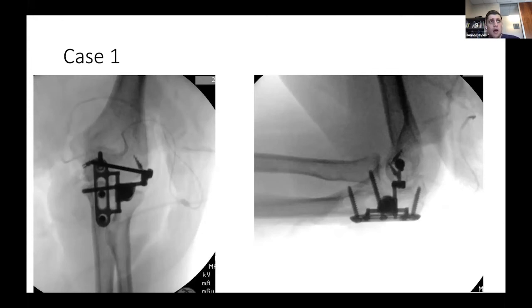And what I look for on the lateral is any lengthening or widening of the ulnohumeral joint, so a sag sign or a drop sign. And I look for radiocapitellar sort of sagging. And then on the AP, I look for an ulnohumeral joint incongruity. So is there widening on the medial side? Is there widening on the lateral side? And if I have none of those things, then I'm stable, and then I'm happy, and then I can leave the OR.